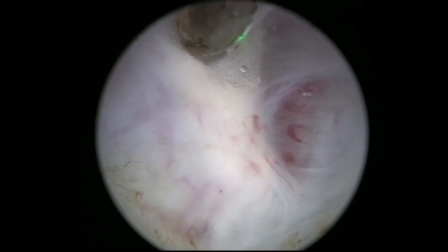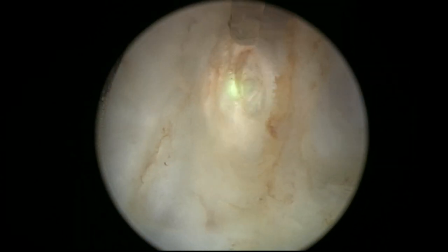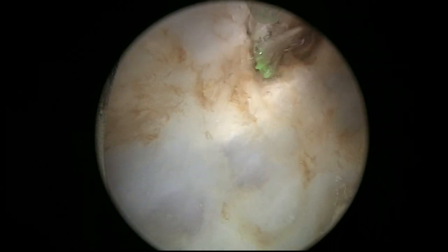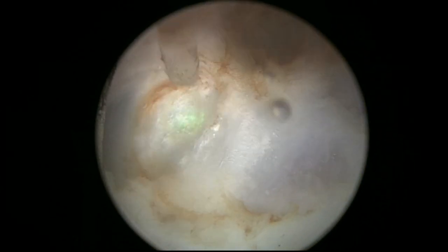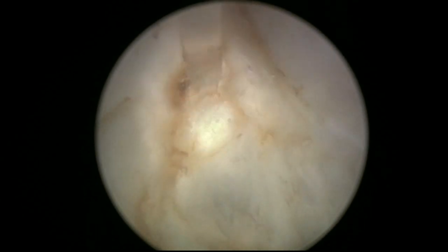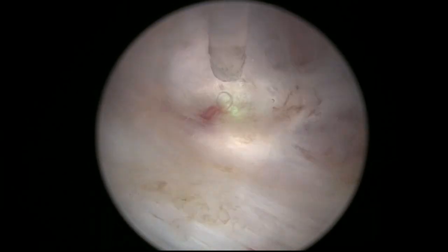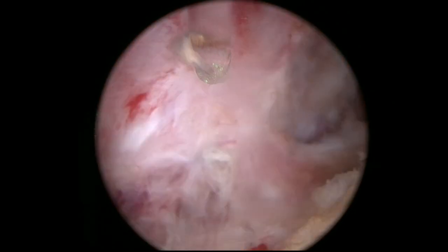You can see it's quite striking how good the hemostasis is when we use this laser. There does seem to be some more cooking of the tissue — everything is a little bit more yellow and more affected, at least superficially. So sometimes I have felt that it is somewhat more difficult to stay in the right plane than when I use Holmium, but I really think the surgeon can compensate for these small differences in laser quality.